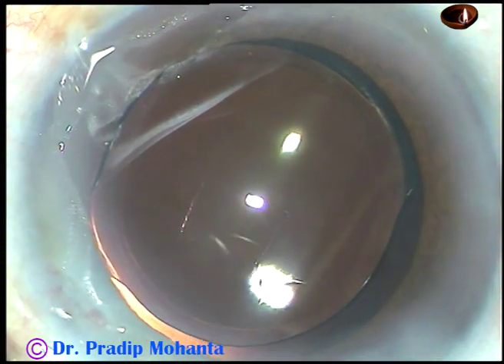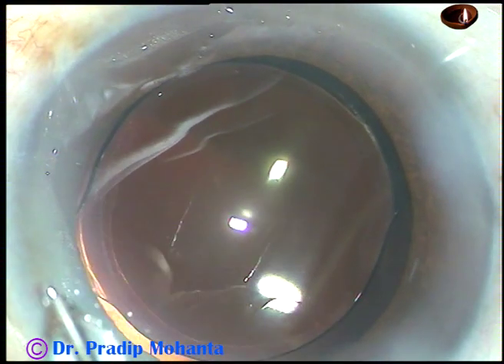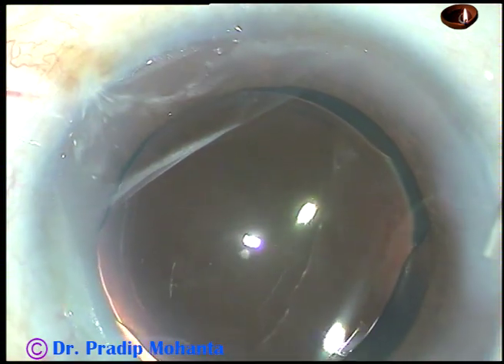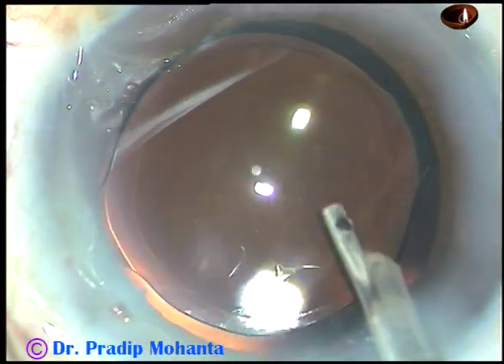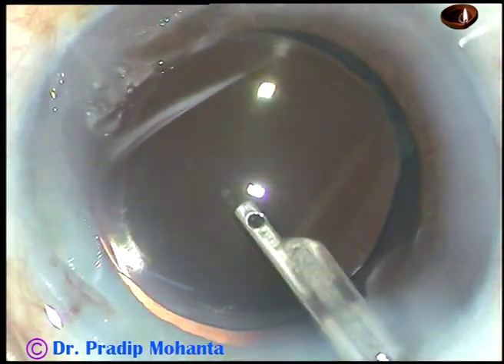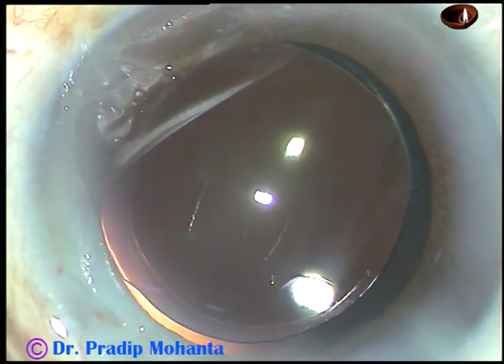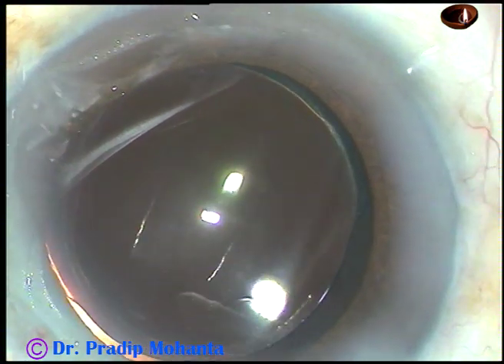And now this is moxifloxacin. The side ports are closed by corneal stromal hydration — the corneal stroma on either side of these stab wounds is hydrated, and these stab incisions become watertight. This is the final lavage of the anterior chamber with balanced salt solution. The anterior chamber is formed nicely, and the integrity of the wounds is checked — there should not be any leakage from any side, and the intraocular pressure should be on the higher side.